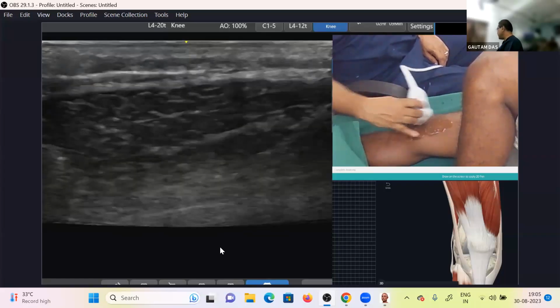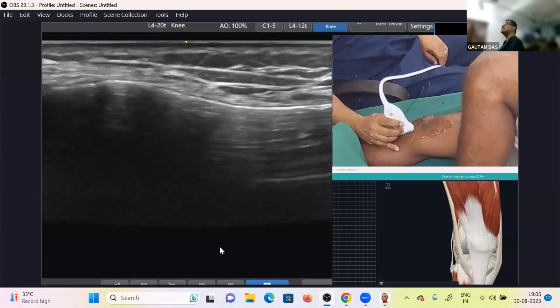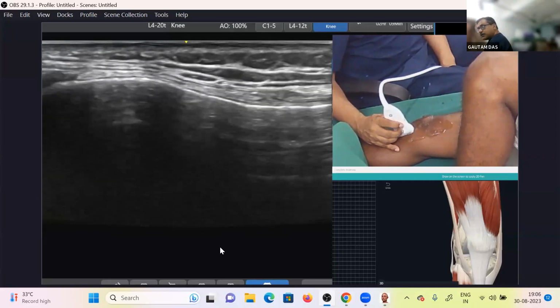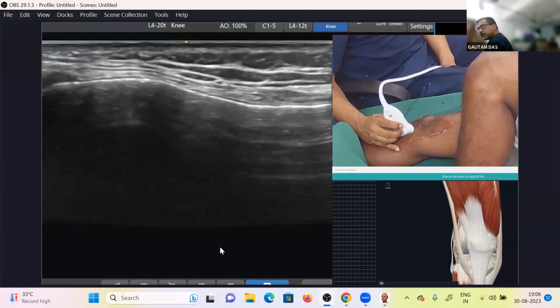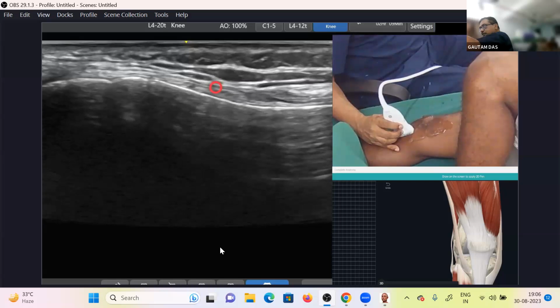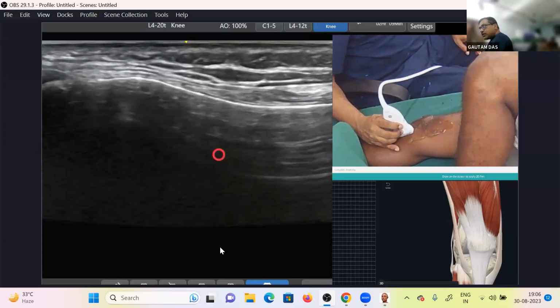And here, the inferior medial also, you have seen the artery. The nerve is also seen very nicely. See, here, just distal to the artery, you see a hyperechoic structure, moving when I'm tilting the probe. Look at the artery at the center of the screen. And just distal to that, can you see a hyperechoic, honeycomb-like structure? This was the artery, and this is the nerve.